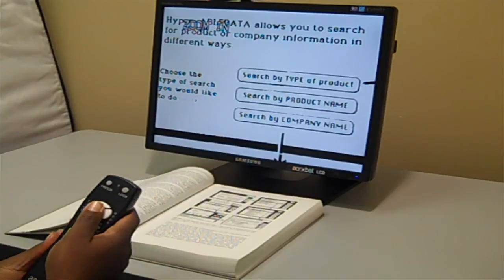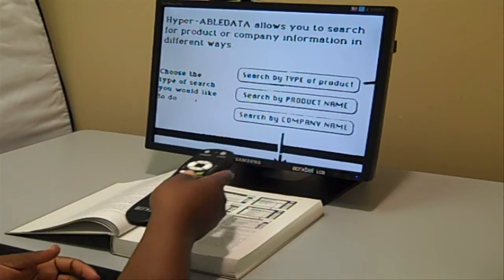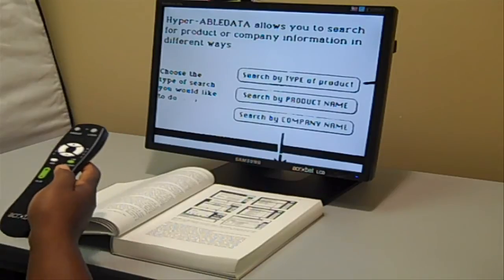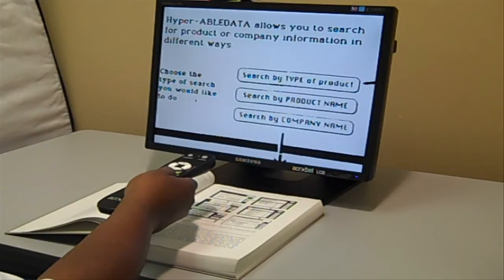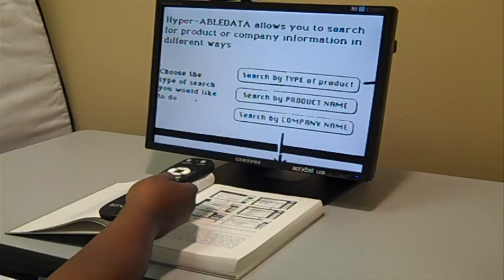You can also enlarge the text. Another feature on here is a line guide — hold it down for a few seconds and it will come up.